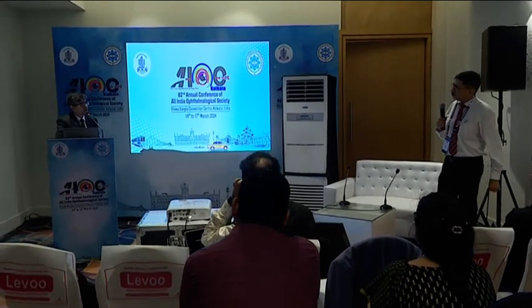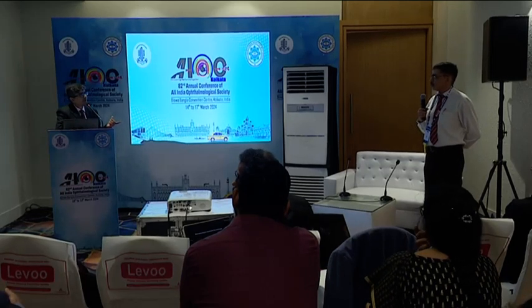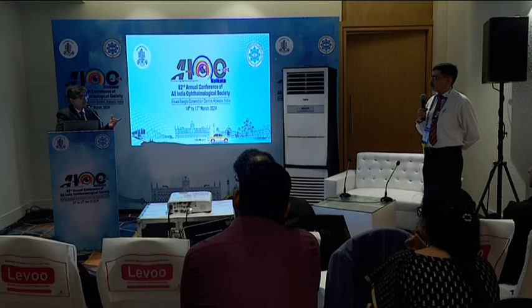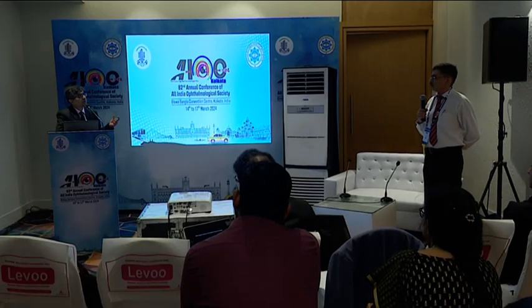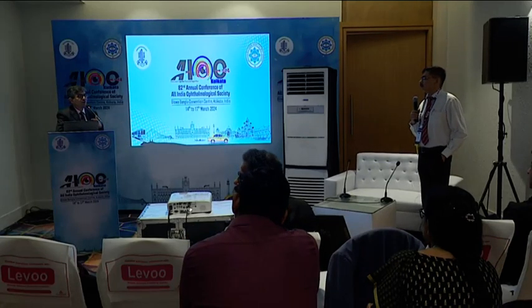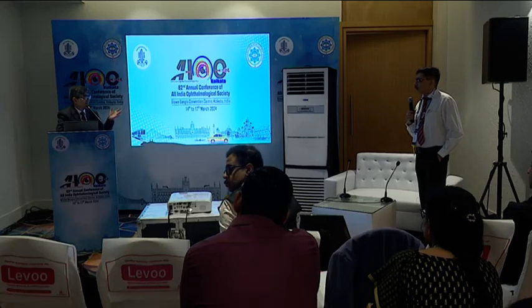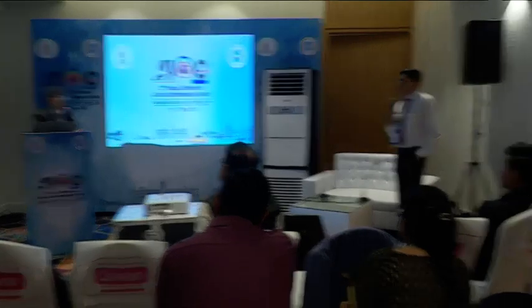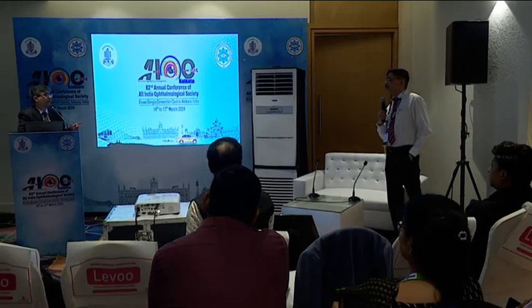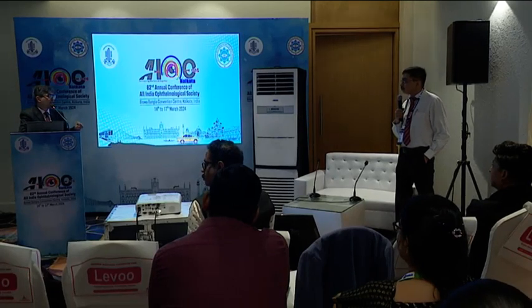So we can use our vitreous infusion suction, what we have. But again, it depends on what syringe you are using. So in that we use a 5 ml syringe. And these tumors or the specimen is so small, we can't aspirate that much. So ideally I would have loved to have a long 26 gauge needle. That's what I'm going to explore today in the trade area, if I can get a long 26 gauge needle. I'm going to try that. Because we put one 23 gauge trocar and put a long 24 gauge needle through that.